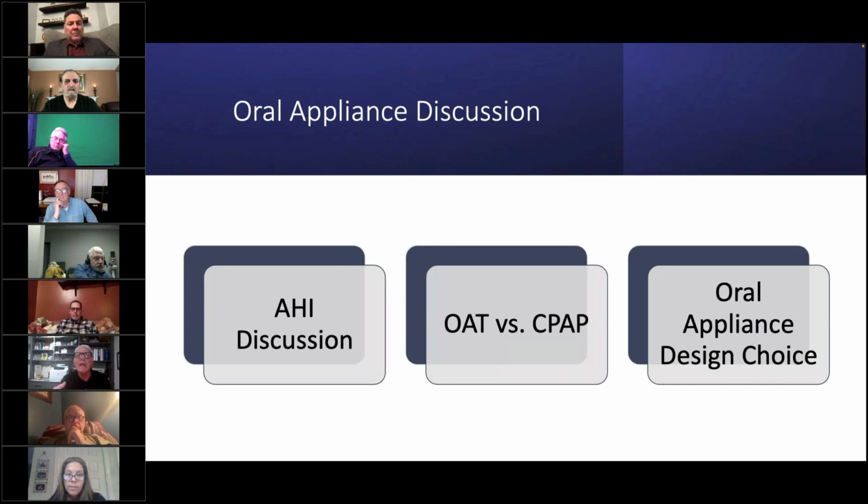So if their teeth are shaped without the bell curve and don't have significant retention, and we're worried about retention, then I wouldn't use a Morpheus. I would use a dorsal appliance that requires less retention because you're not fighting the depressors during the night. The mandible can open and you won't disengage. So that makes perfect sense.